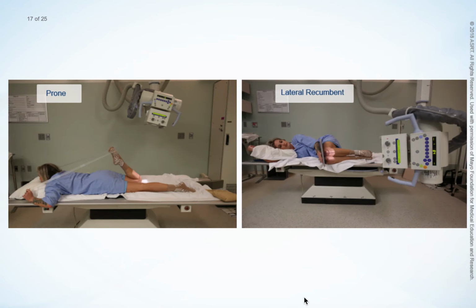A tangential projection using the Settegast method can be performed with the patient seated, prone, or in a lateral recumbent position, although the prone position is generally preferred because it allows for a greater degree of knee flexion. Before this projection is performed, a lateral image must be obtained to rule out a transverse patella fracture. If a fracture is present, positioning the knee in acute flexion as required for this projection could cause fragment displacement. This projection also may be difficult to perform when the patient is in severe pain.